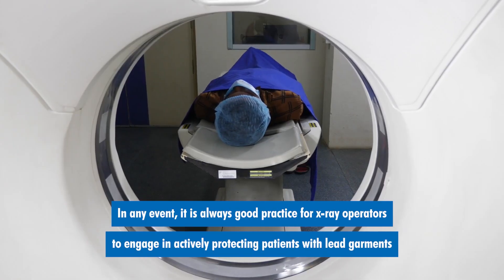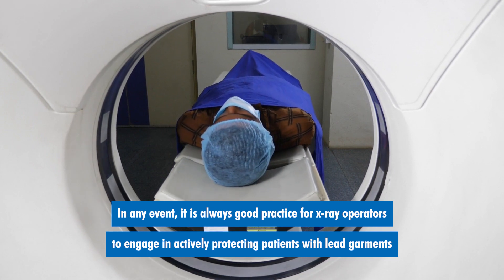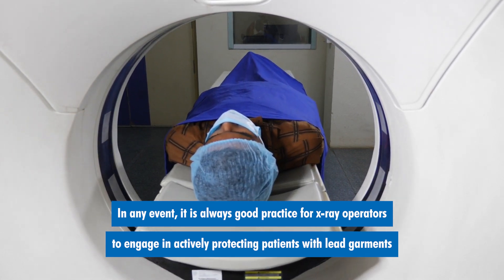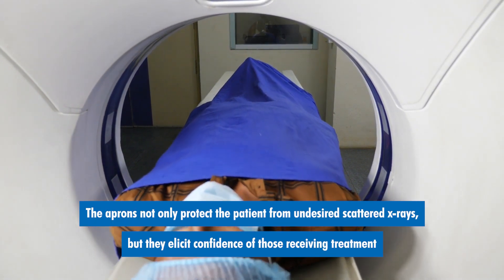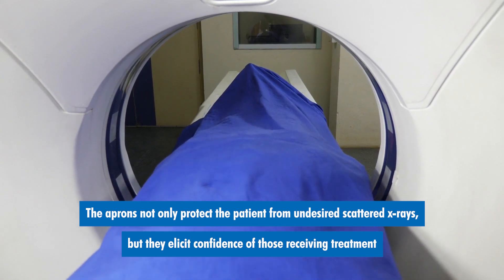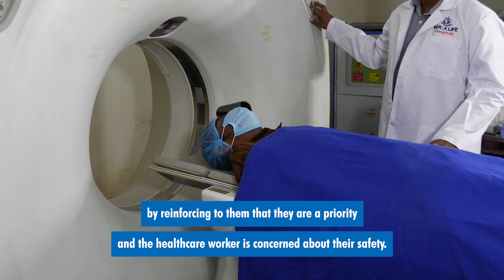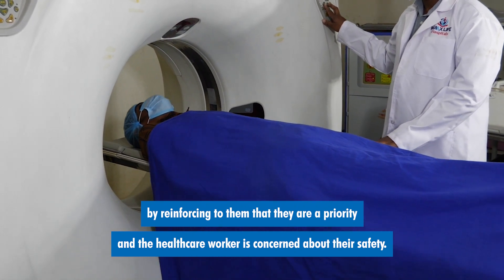In any event, it is always good practice for x-ray operators to engage in actively protecting patients with lead garments or protective aprons of some sort. The aprons not only protect the patient from undesired scattered x-rays, but they elicit confidence of those receiving treatments by reinforcing to them that they are a priority and the healthcare worker is concerned about their safety.